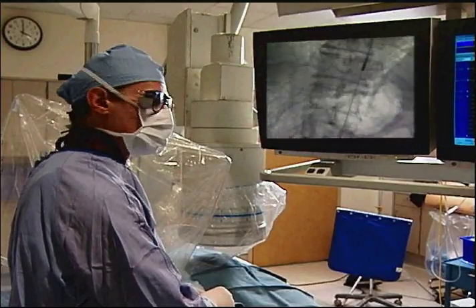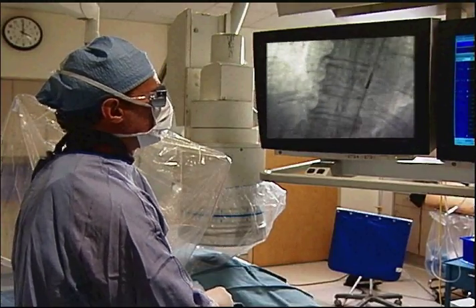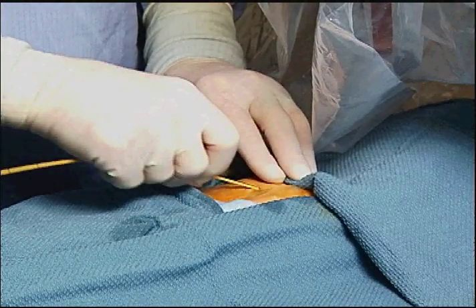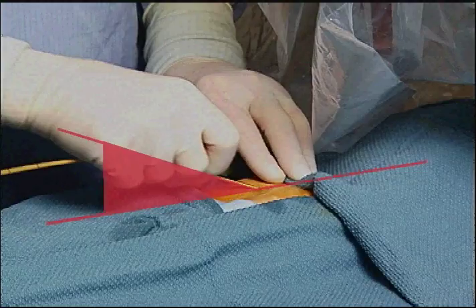Be sure to use the wire supplied, as it has been specifically designed for optimal catheter tracking. During insertion, hold the balloon catheter close to the skin line to avoid kinking the catheter or inner lumen.